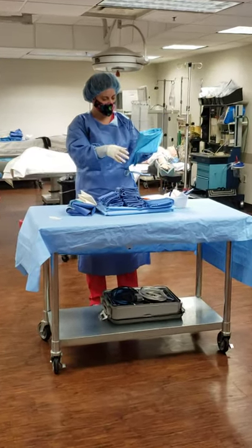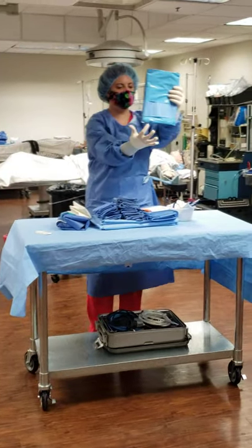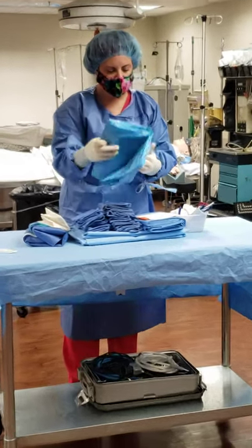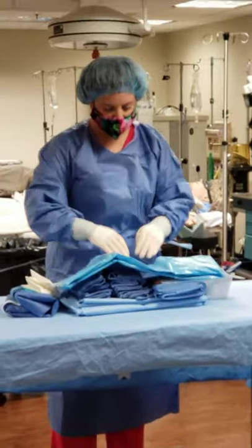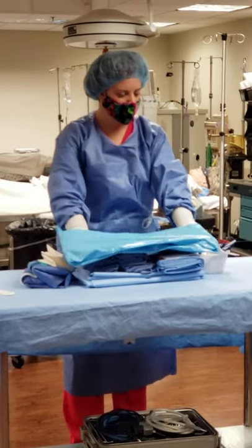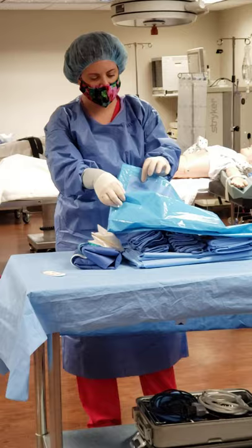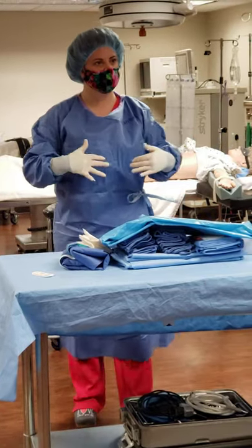Sometimes it's buried in the sack. I'll have to dig through and find it. It does have some direction. See it has two little paws right there. So you're going to orient it over your back table. Find where your paws go. And then if you're not careful, all of this that's kind of tucked into this cuff will unfurl.